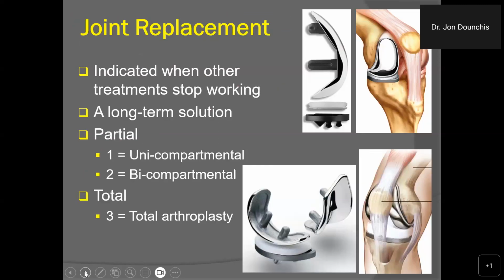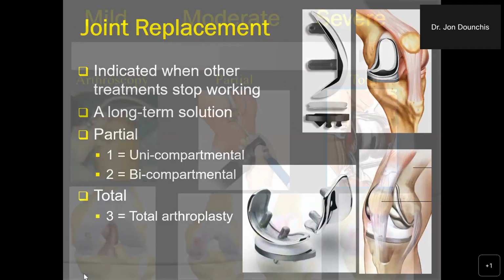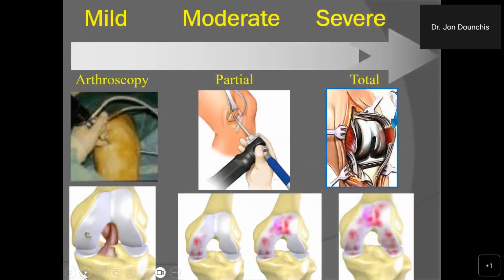So depicted to the top right is a partial knee replacement. You can see just a portion of the knee surface is replaced, in this case on the medial side. And in the bottom right is a full knee replacement. Next. And down the bottom, we go from mild arthritis to moderate to severe arthritis. So depicted in the bottom left, we have just a small dime-sized defect in the articular surface.